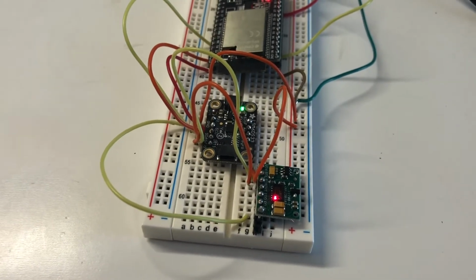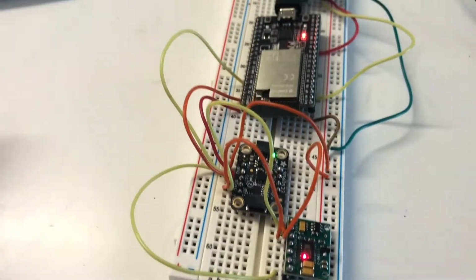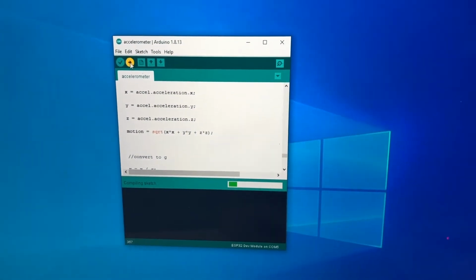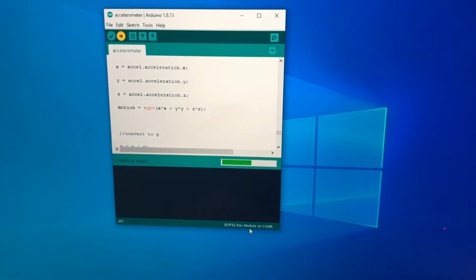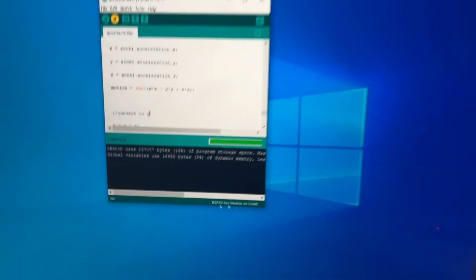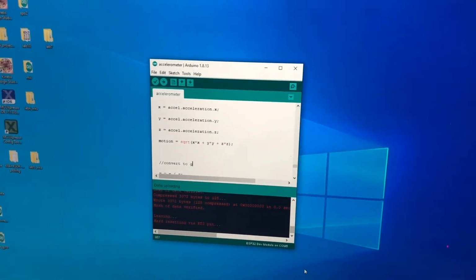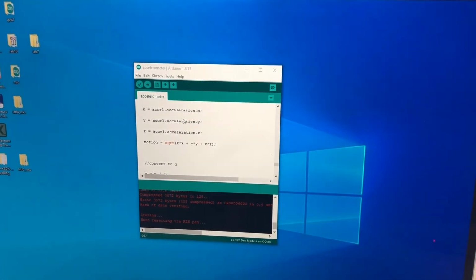So first we have our accelerometer and gyroscope, which is the gray board right here connected to the ESP32. We are using the Arduino IDE to program, and so I will click this upload button to load our code onto the ESP32. You can see on the bottom right here that our microcontroller is connected to the USB, so via serial communication. And so the IDE will connect to the board and basically write, and then reset automatically once it's done. And we can observe our results on the serial plotter.